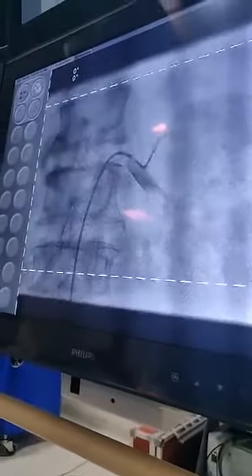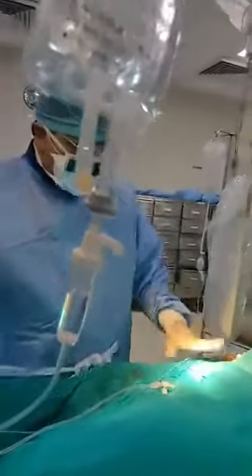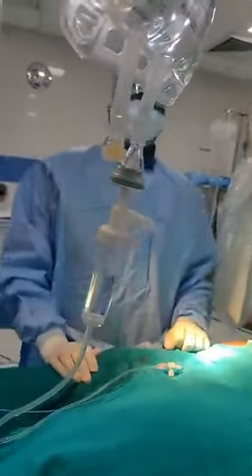Now I will see the renal arteries — arteries of the kidney. This is the left kidney artery and this is the right artery of the kidney. I have now removed the catheter and the patient is fully conscious.